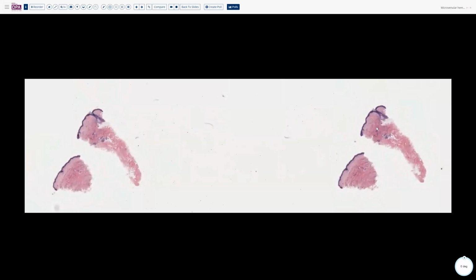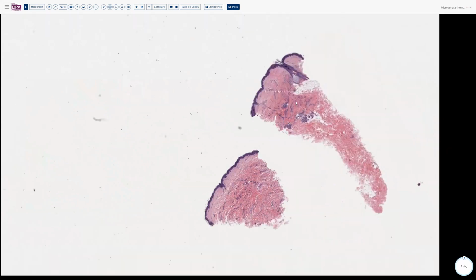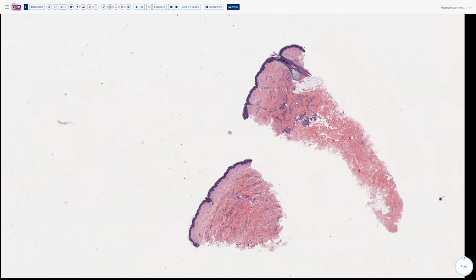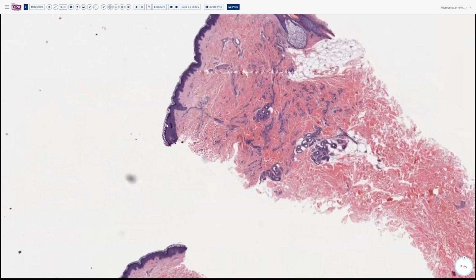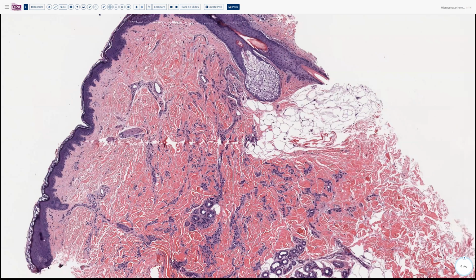These clinically are sort of purplish nodules or plaques that present on the limbs. They tend to be somewhat wedge-shaped. So here's one where you don't see the margin, so you can't tell that it's wedge-shaped per se. But you can see that it has these very compressed but prominent thin-walled vessels. And here we're mostly cutting across them, so we're not seeing very many linear forms in this example. But there are a few areas here that sort of fit into that category as you come down some of these areas.